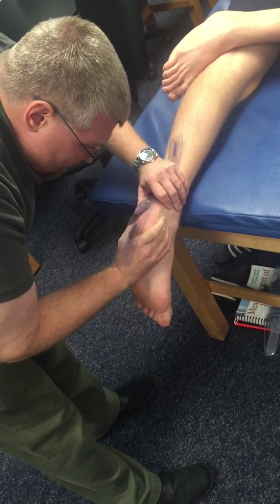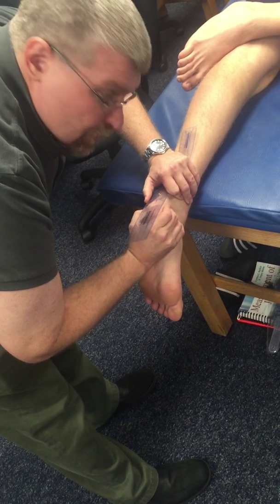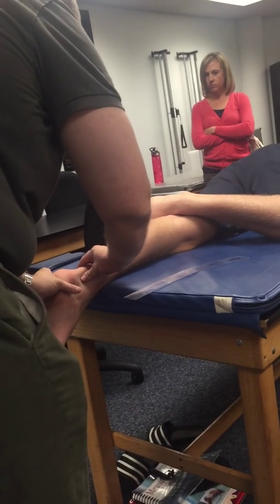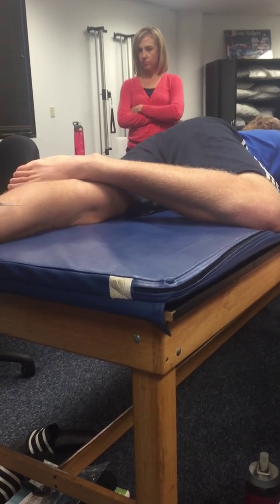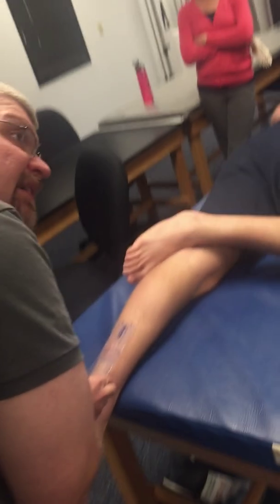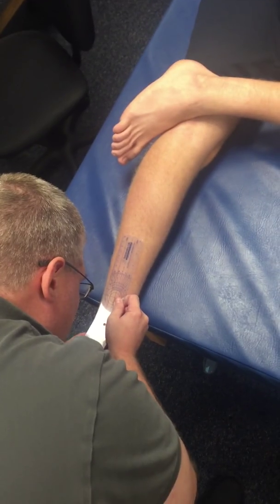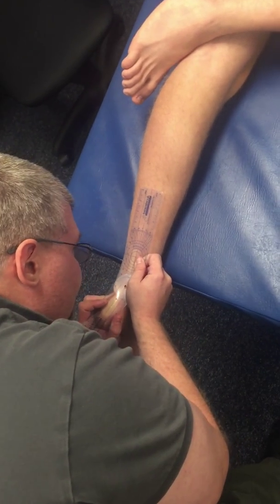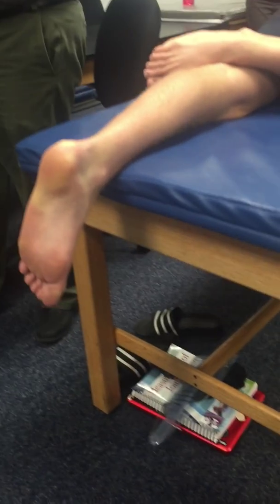Then I'll bisect the two and get my number from zero. I do the same thing for eversion, except now I'm just going to evert the calcaneus — not as far. Same exact alignment: get my axis, put my line, find midline, evert the foot, and get my number — about 10 degrees or so for that direction.